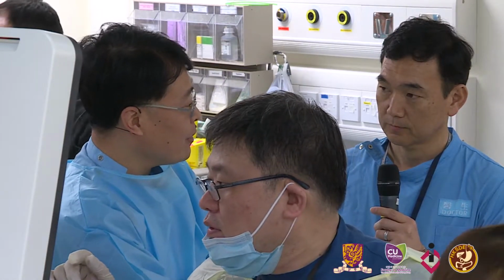Have you had a problem before? Yeah, that's true. And sometimes SMT FNB is difficult, especially for small lesions, also less than 1 centimeter. Cytology is not enough for a lesion like this. I think pathology is mandatory for this kind of lesion. But we can't have 100% definite pathology captured for a lesion like this.